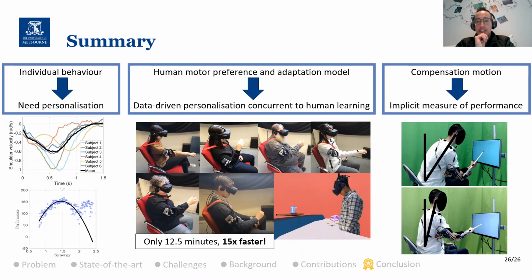Yeah, I didn't look at it personally, but there is some work on this in the whole sense of learning about synergies that occur in reaching, and people have been able to estimate from measurements of angular position and angular velocity, so 6 degrees of freedom, the IMU position and angular velocities, to estimate reaching from a single start position to, I think, a plane in front.